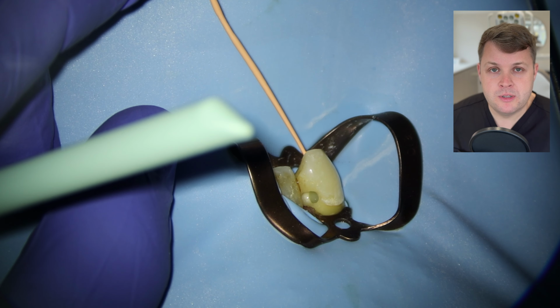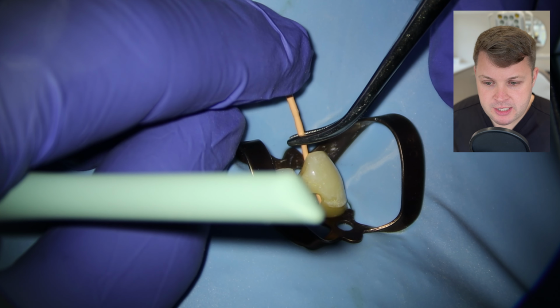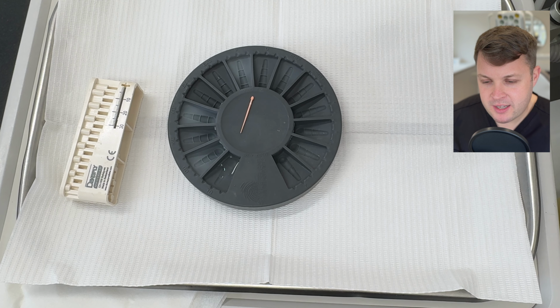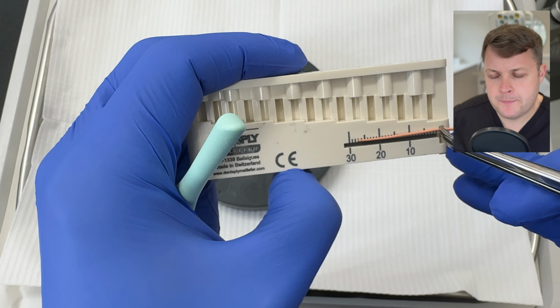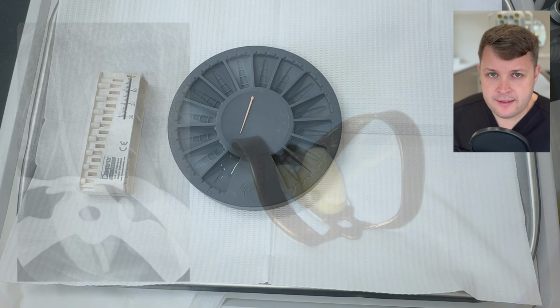And I've rolled it a couple of times now. You can notice that it's a bit thinner and also a bit longer, and now it reaches quite nicely to the correct length, and you get a little bit of tug back. And we see here that when we measure this now, it's at 27.5 millimeters, so super satisfying. And then obviously we're going to place this to length.